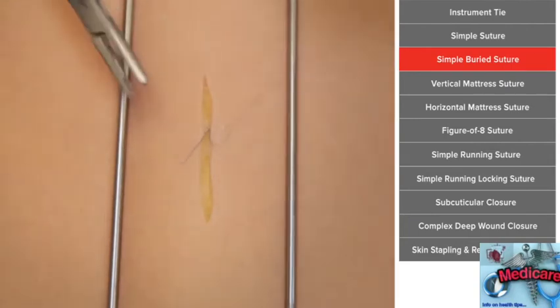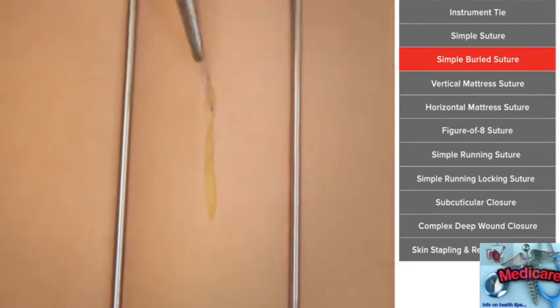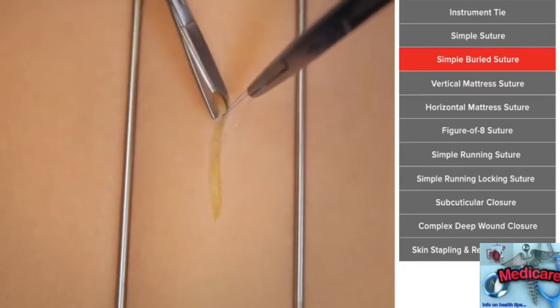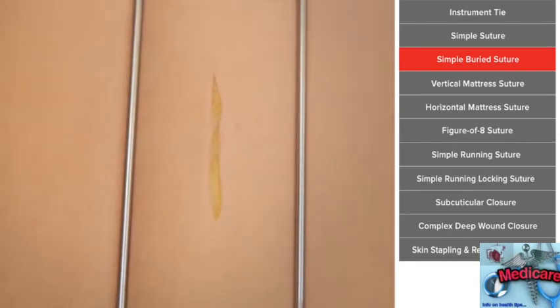Notice also when I'm pulling, oftentimes I'll pull it along the wound. It allows you to get the tie all the way into the wound, and it's not being prevented by the skin edges. So this is a simple buried suture. This is something that we use all the time in plastic surgery.